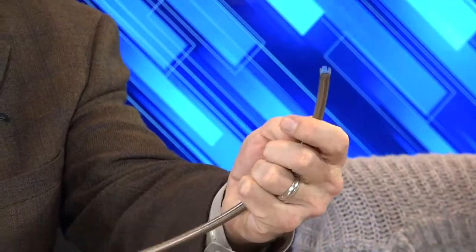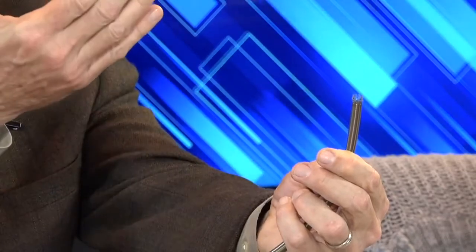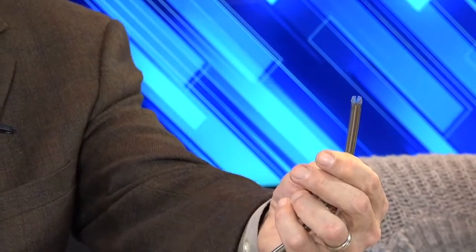Let me go back into here. There we go. So you'll actually retract the funnel into the oversleeve. That oversleeve will allow you to place a dilator or an obturator and a wire right on through. Once you're in position where you want to be, wire and dilator come out, and then a little quick advance of your cannula, and you can see the funnel automatically expanding, same shape every single time.